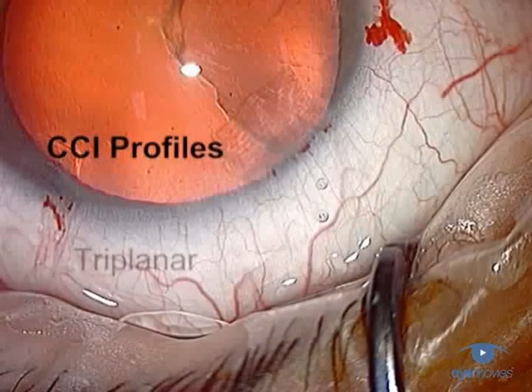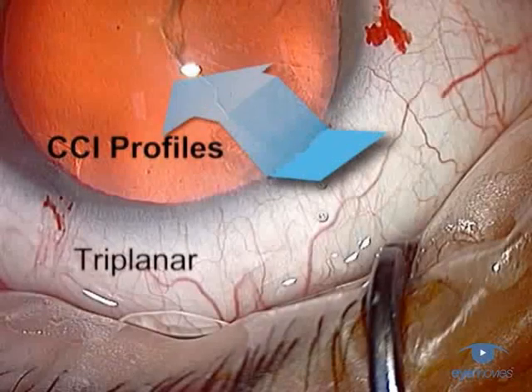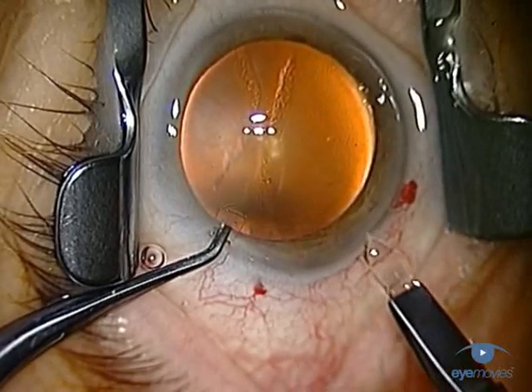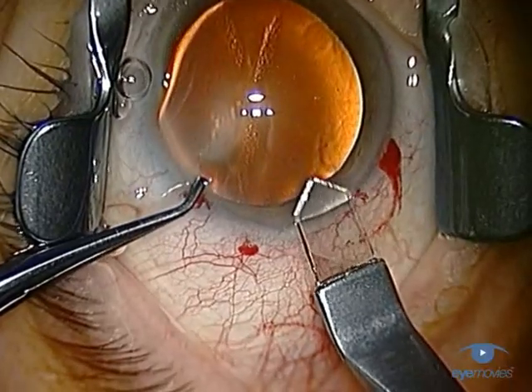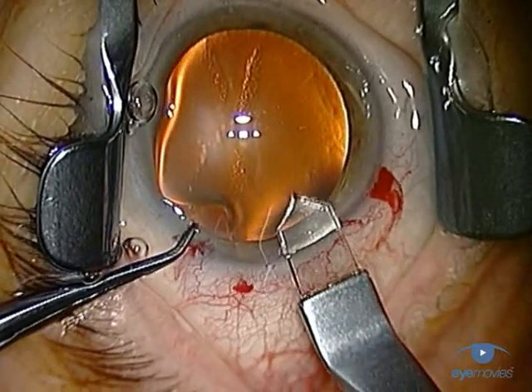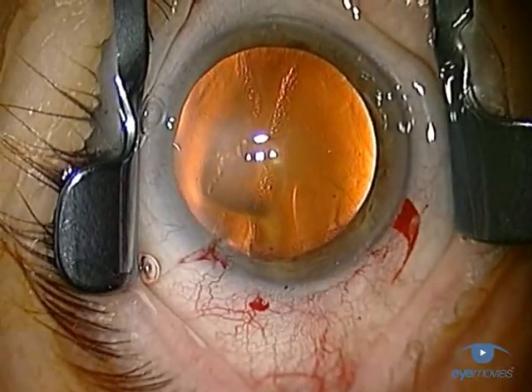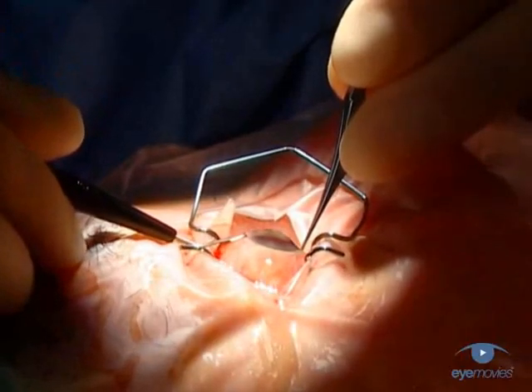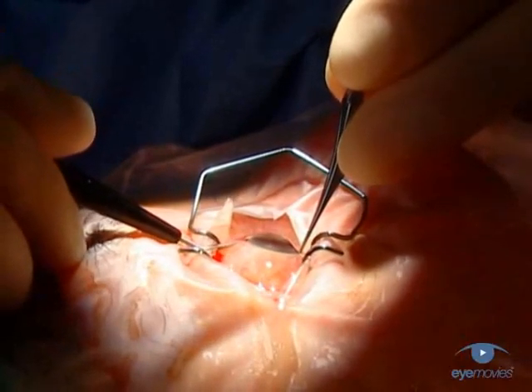The architecture of the triplanar or three-step clear corneal incision was originally designed in an attempt to guarantee a self-sealing and completely secure wound. Practically speaking, it's difficult to be convinced that it's any more stable or watertight than a simpler two-step incision. The distinction is probably not one of any great practical significance. The third step simply involves making an angled rather than straight entry into the chamber.